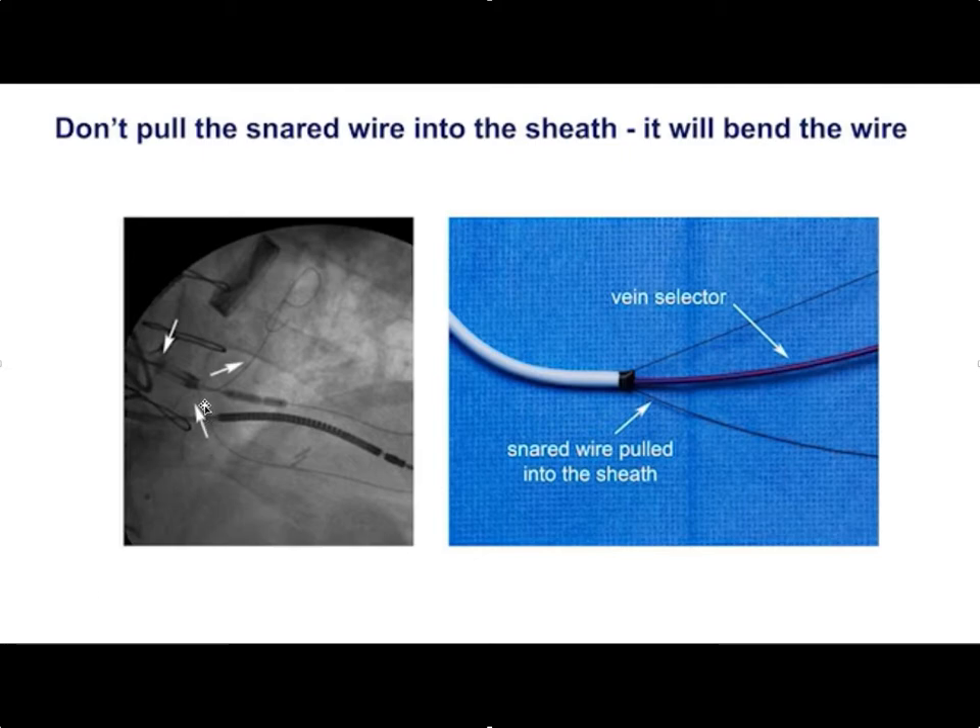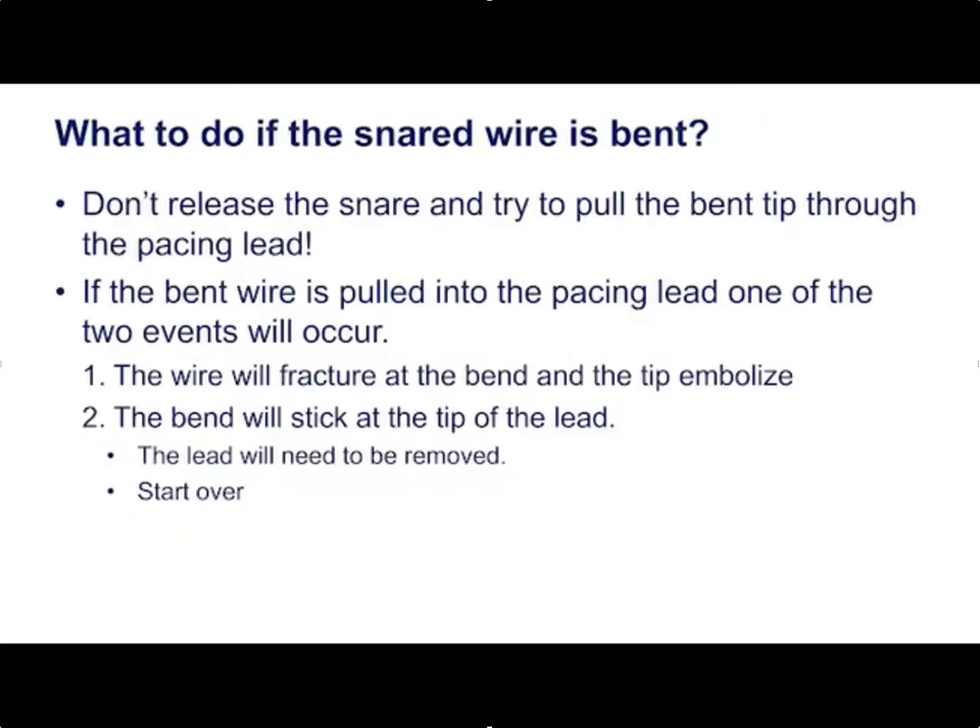You don't want to pull the snared wire into the sheath. As happened here, the wire coming out of the middle cardiac vein was snared up into the sheath and back out into the coronary sinus, which bends the wire and can make it almost impossible to get the wire back through the pacing lead. If you do bend the wire, don't release the snare and try to pull the bent tip through the pacing lead — you can fracture the tip off or be unable to get the lead out.